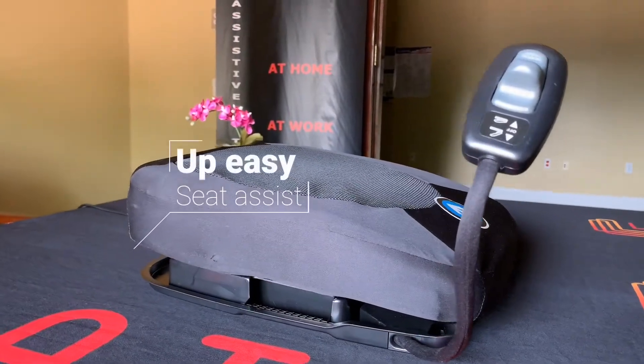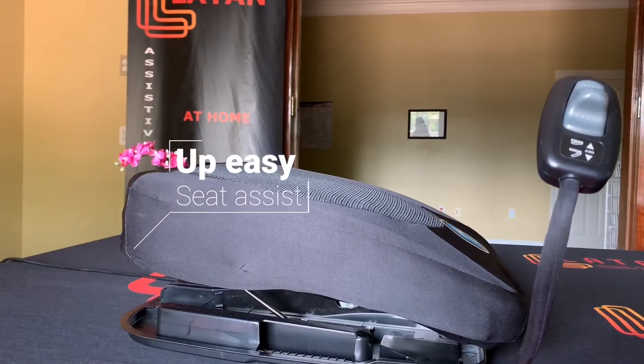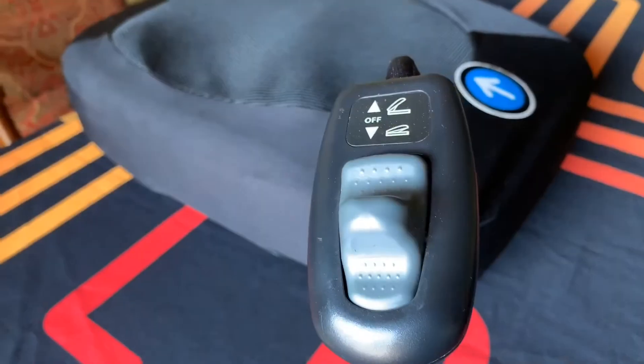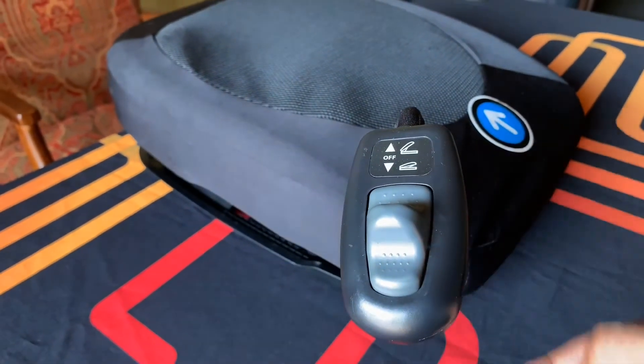This is the UP-Easy Seat Assist. The Seat Assist is controlled using the remote that comes attached. Simply press the button to go up or to go back down.